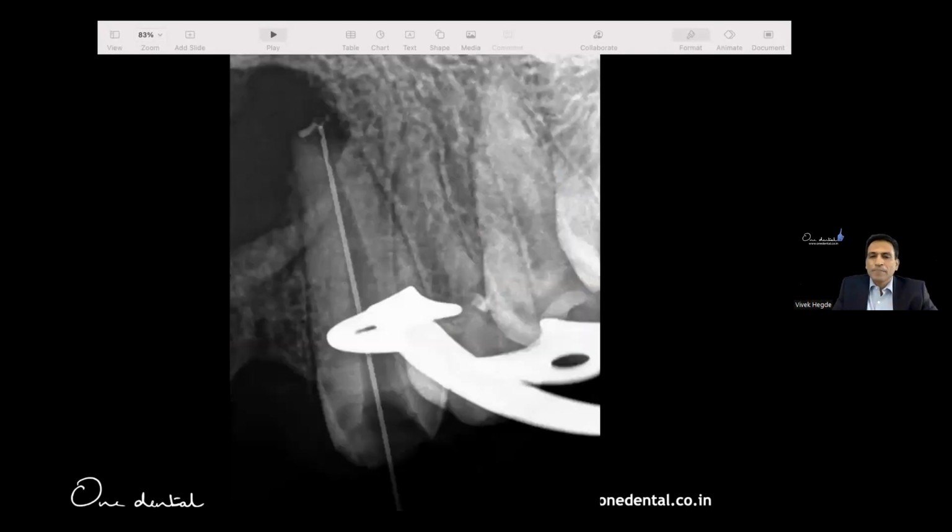So here's an example. Now, I'm going to give you another example. Here's an open apex. I have a double-vented, blunt-ended needle. If I irrigate with this, maybe with a 5 cc syringe, in an open apex with 5% hypochlorite, we had it. Please be very careful. In an open apex, you're going to use diluted versions of hypochlorite. The argument will be, when it's 5%, 6%, people also talk of 8%, activated, we'll come to all that. What does it do?